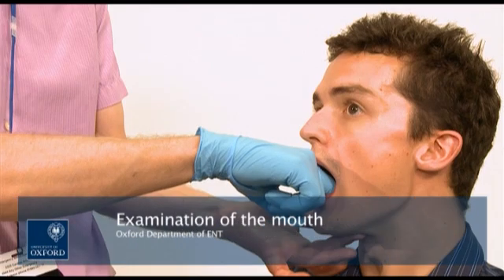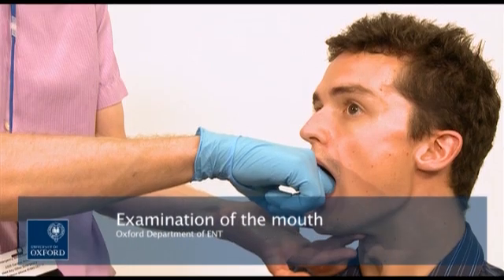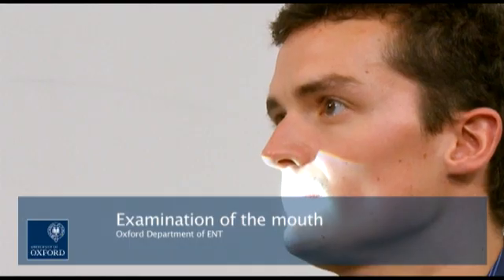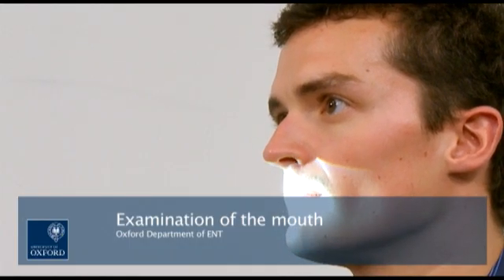This video covers the examination of the mouth. The examiner has already washed his hands, introduced himself to the patient and obtained their consent. Examination of the oral cavity requires a headlight and two metal tongue depressors.